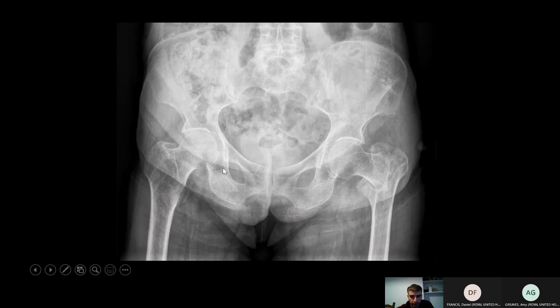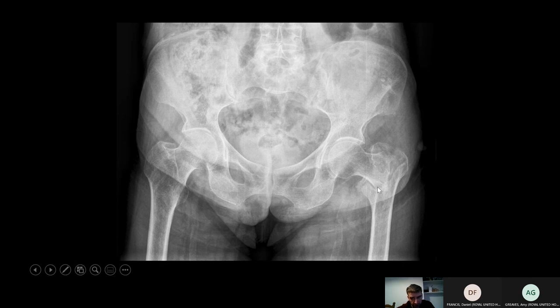Here's another plain film of a pelvis showing a basicervical femoral neck fracture. It can be difficult to differentiate between basicervical and intertrochanteric, but hopefully you can agree that here the lesser trochanter is still intact and the greater trochanter is still intact, with the fracture pattern somewhere along the neck. This is probably just within the realms of being fixable.